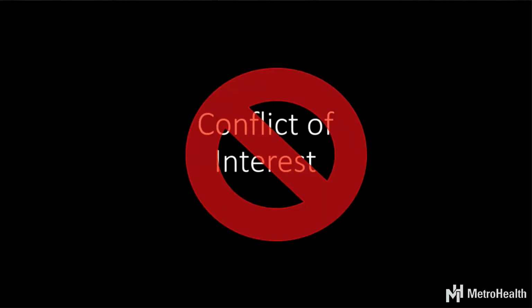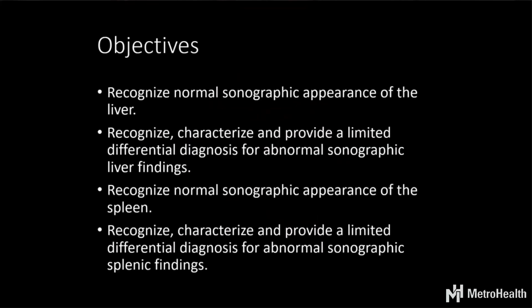So our objectives, and I have to put these up: basically what's normal, and then what's abnormal, and develop a limited differential for those abnormal findings for both the liver and the spleen.